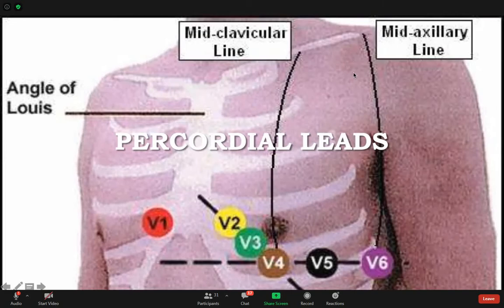This is very important clinical skills, is you need to know how to do an ECG. عادة nurses, they do this. But you need to know it too. Sometimes you're going to be in the floor and you don't have a nurse that know how to do it. So sometimes you need to know.